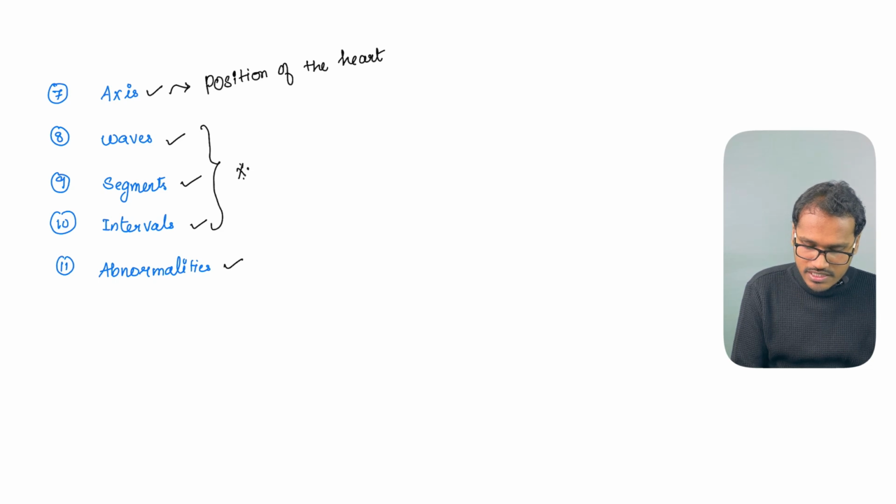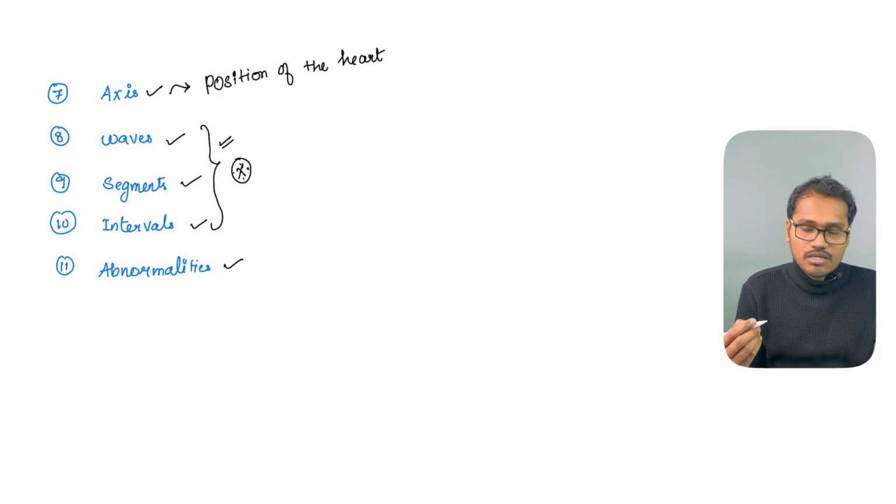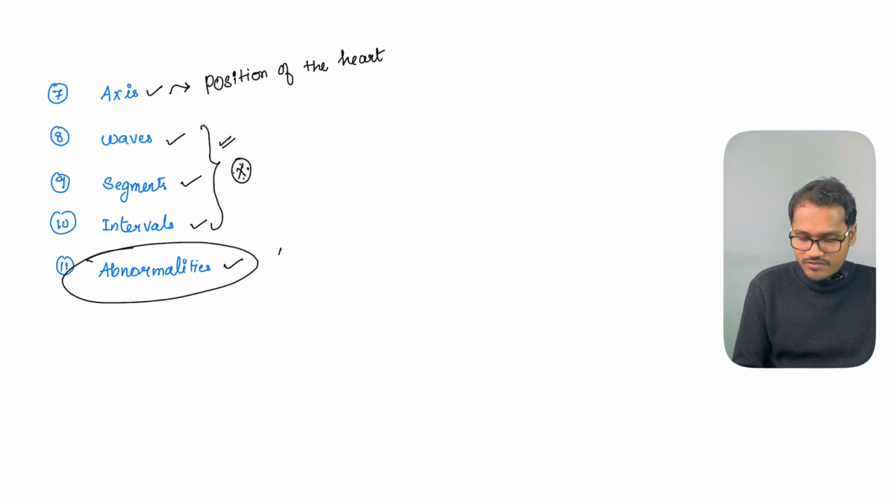Waves, segments, intervals: I have already discussed in the previous video the significance of the waves and their normal duration, and when it prolongs, what the abnormality is. And then finally, at the end only, we come to the abnormalities.